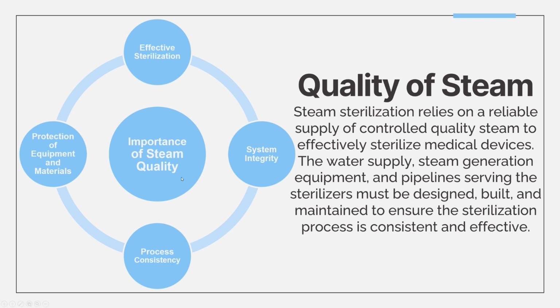Of course, process consistency hinges on controlled steam quality. So variations in steam purity or pressure can cause cycles to fail or become unreliable, posing serious risks to patient safety. So maintaining steam quality supports reproducibility of sterilization outcomes and compliance with regulatory standards.